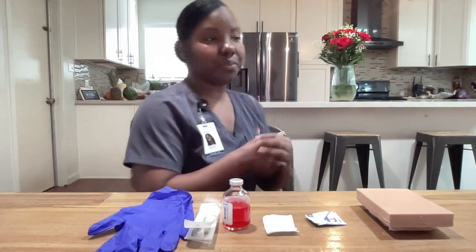I will gather my supplies and proceed to my patient's room. I will knock before entering. I will close the door or curtain behind me to ensure patient privacy. I will set my supplies down on a clean, dry, flat surface. I will perform hand hygiene and proceed with my patient.